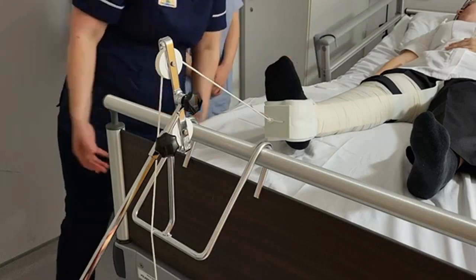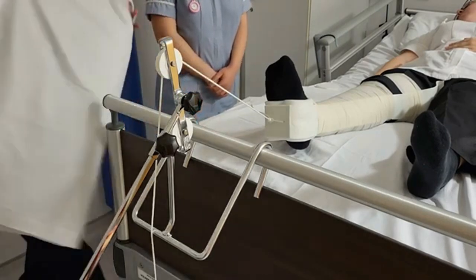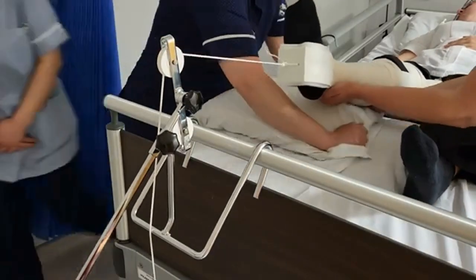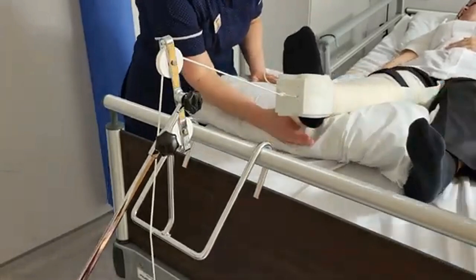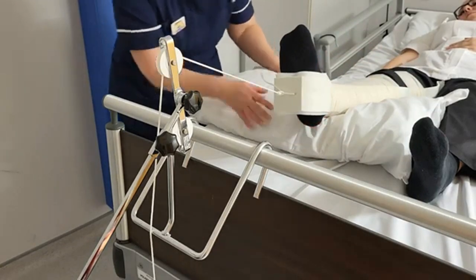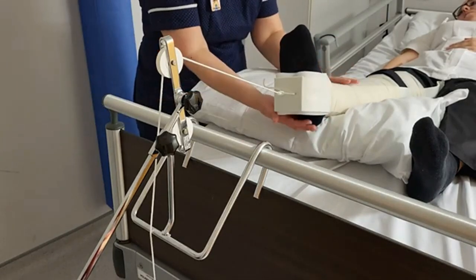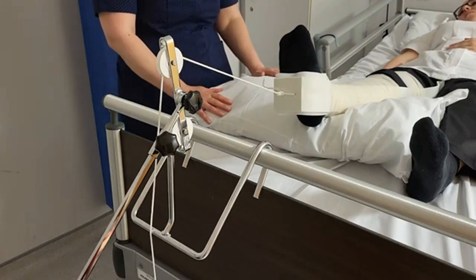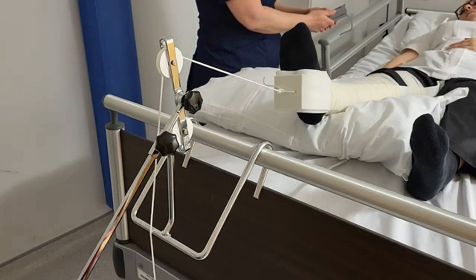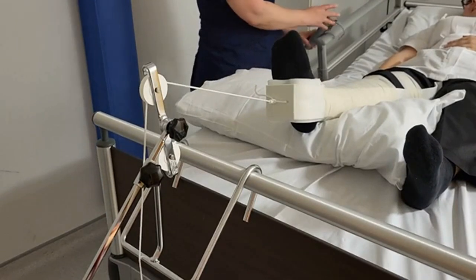If we don't have that, we can stick a pillow underneath the bottom of the mattress to lift up the end of the bed. We also want to keep the heel off the edge of the bed, so we place a thinner pad, blanket, or pillow underneath the leg, allowing the heel to be free. She's much more comfortable, her leg is supported, and she's not going to get pressure sores on her heel. Ideally we would have a bare foot so we can inspect the circulation. The head end of the bed can also be tilted so the child can sit up and eat as they wish.